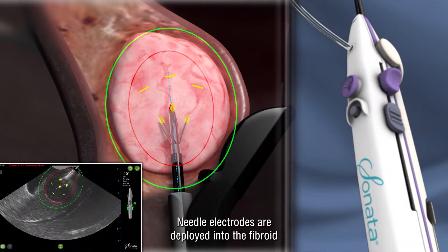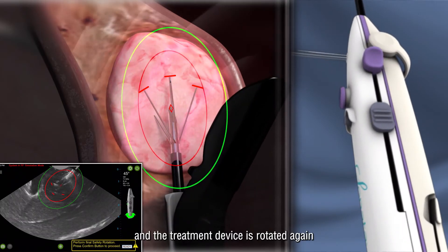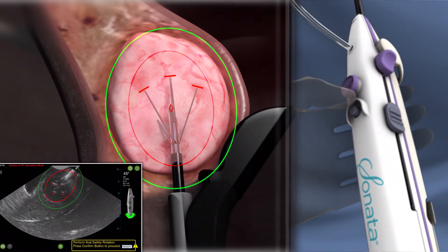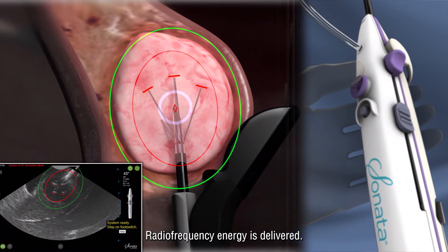Needle electrodes are deployed into the fibroid and the treatment device is rotated again to confirm safety. Radio frequency energy is delivered.